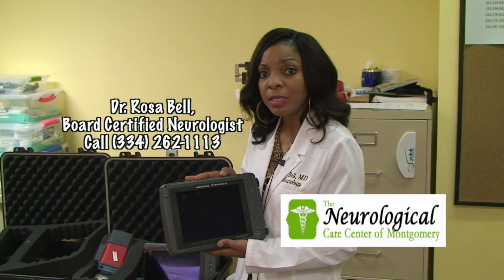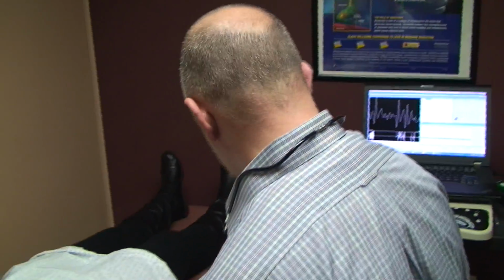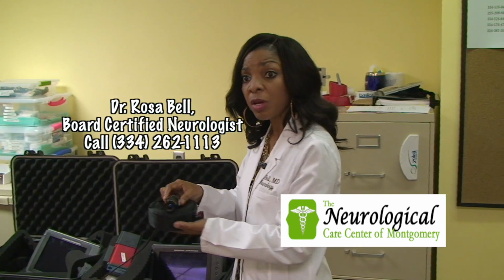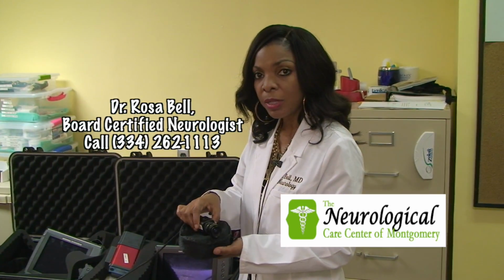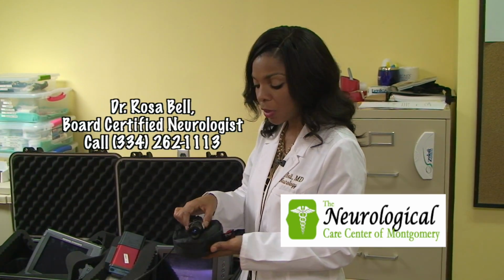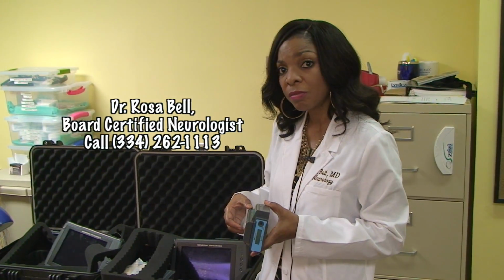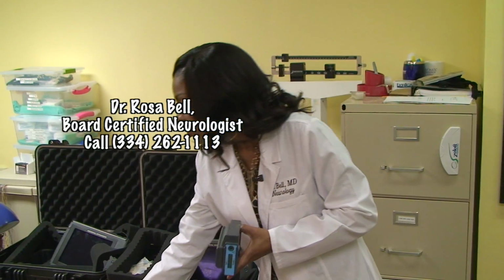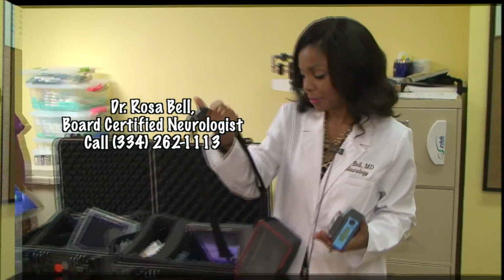And one of our lovely staff members and technicians would be placing the electrodes on the patient. And we would also be videoing the patient. The patient takes this little camera home with them, and they take it wherever they're going in their room, in different areas of their home, and they monitor themselves with this camera. This is the little device that we actually plug all the electrodes into that are on the patient's scalp monitoring the brain waves, and the patient carries it in this little pouch and straps it on them like a little purse or bag.